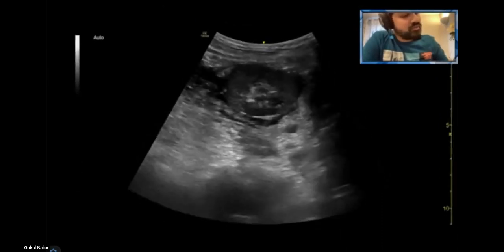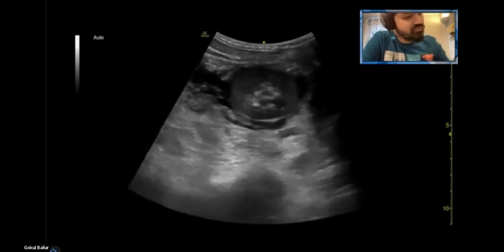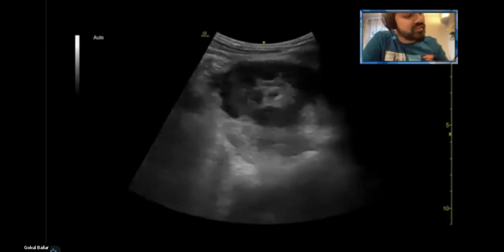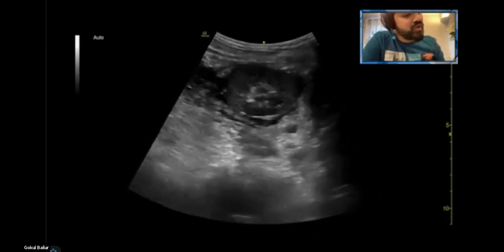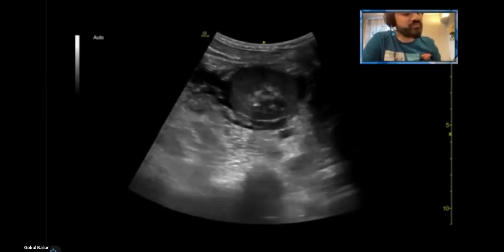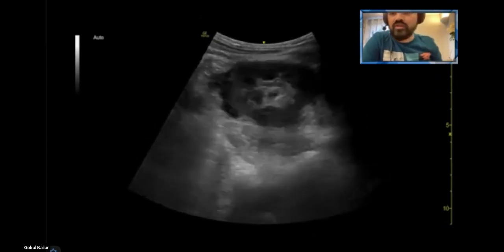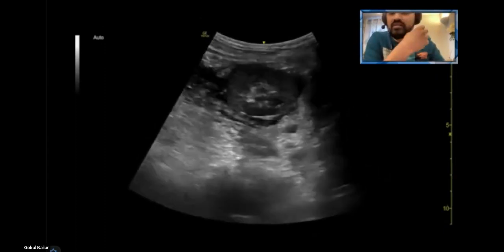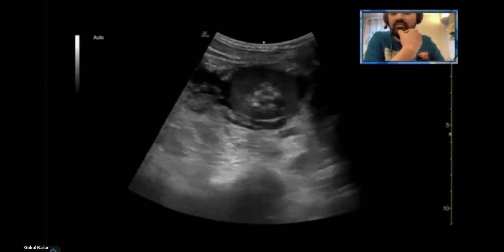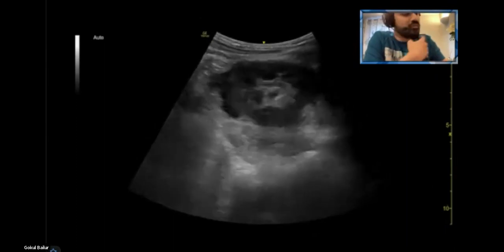And looking at the other pole, I'm going down now towards the lower pole, and I see a lot of fluid and some stranding around the kidney. I can't really see the capsule well. I'm now worried whether the pain has subsided because she's burst, or there's some urinoma or inflammatory changes around the kidney. So we had a quick look at the blood test results, and the bloods were completely normal at this point. Normal kidney function, normal white cell response, normal neutrophils. CRP was normal as well.